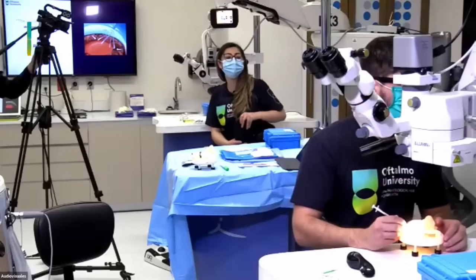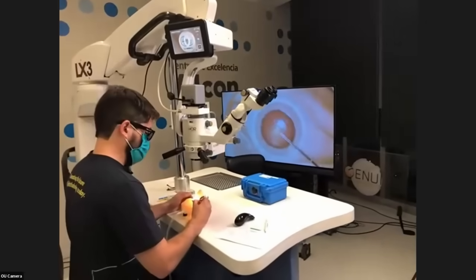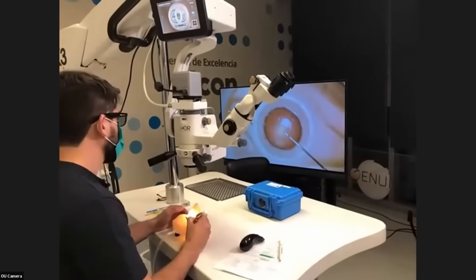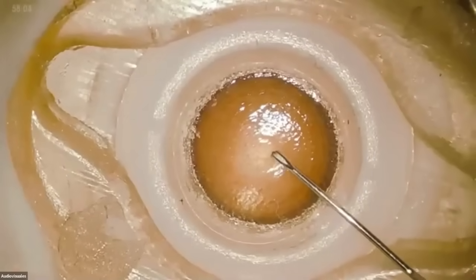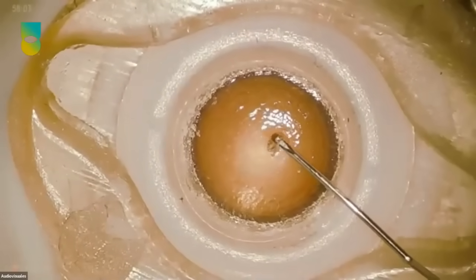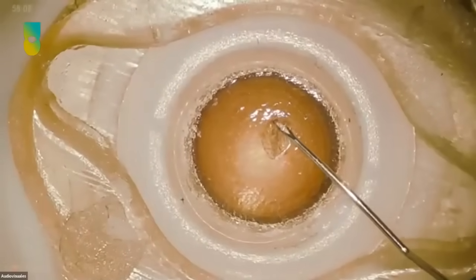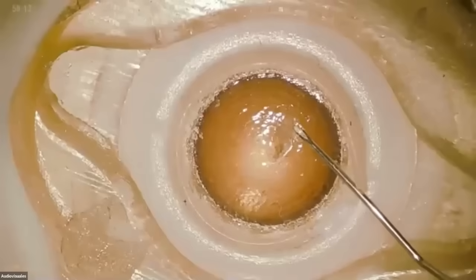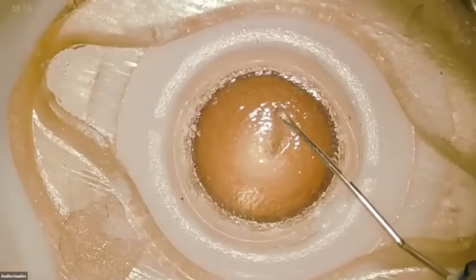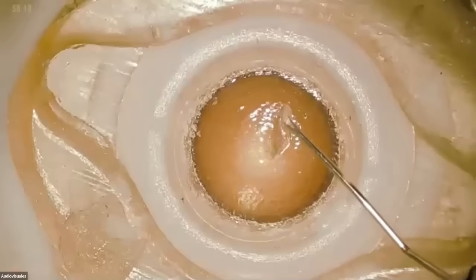So if you have long forceps, in micro incisions they don't work, because you have to retake many times your capsulorhexis, your capsule. You need a smaller, shorter forceps, especially in the left eyes.